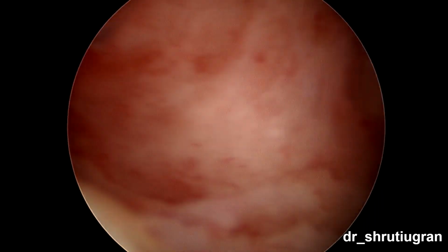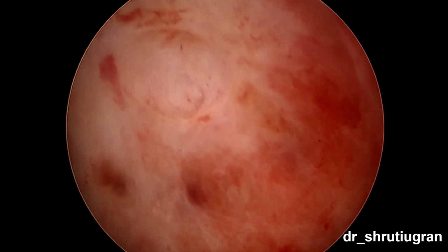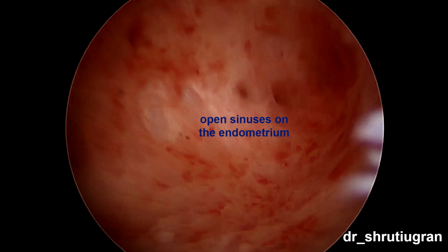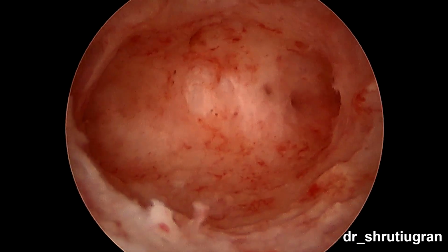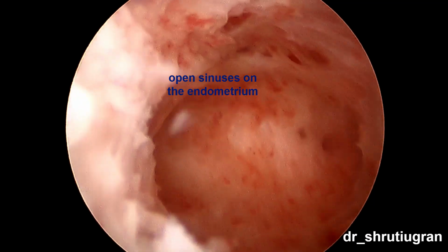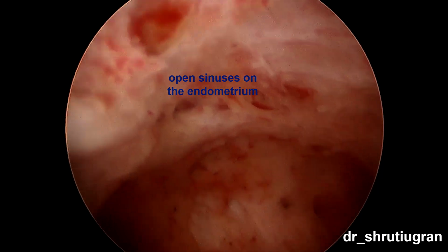We can see the right ostia over here, but the opening has multiple periostial adhesions and trabeculae. The left ostium is hardly seen. We can see only the periostial area. We can also see multiple open sinuses on the endometrium, probably where the endometrial tissue had invaginated into the myometrium. On drawing the scope outwards, we can see multiple open sinuses also on the anterior wall of the uterus.